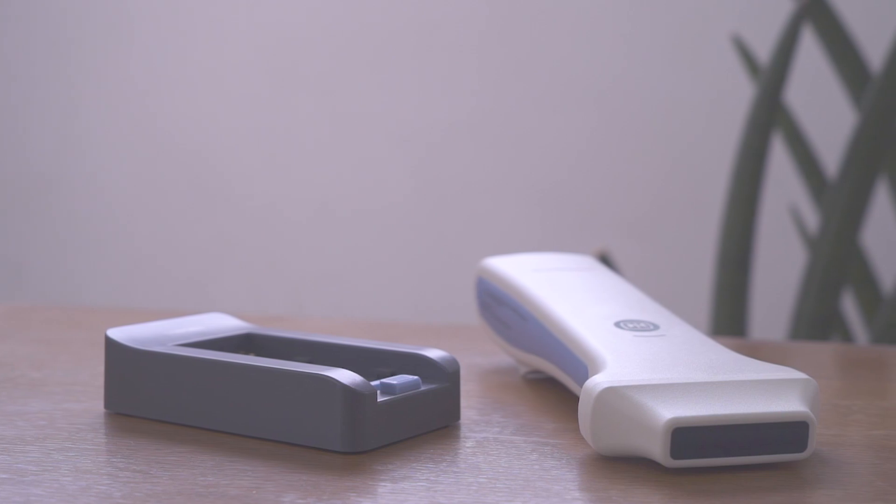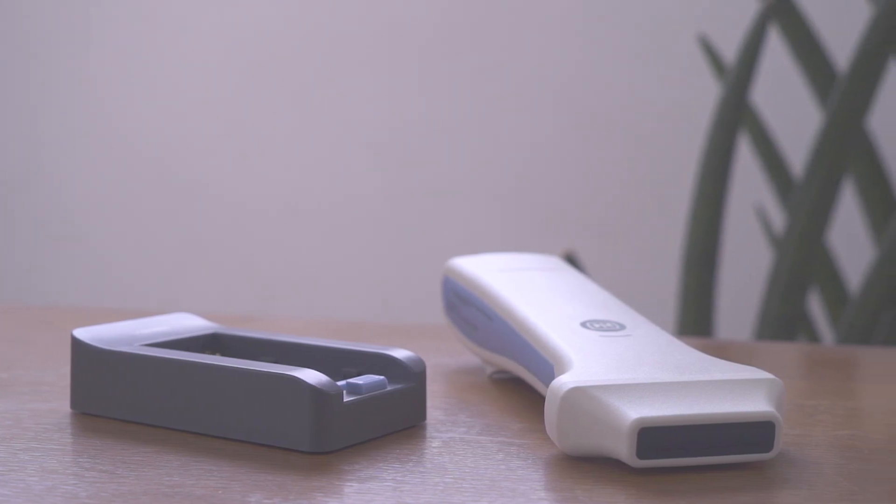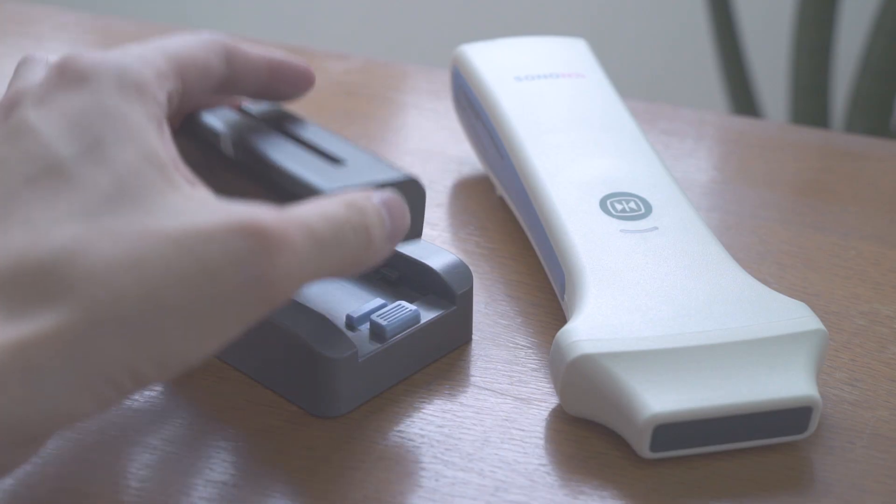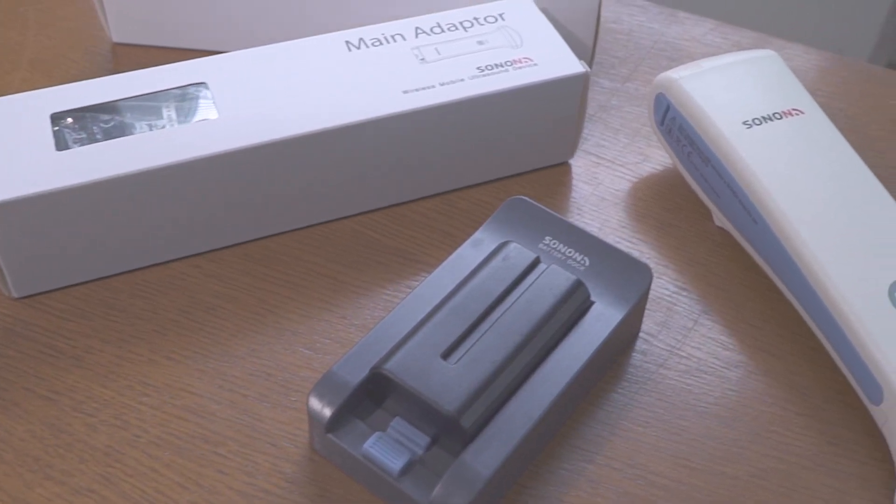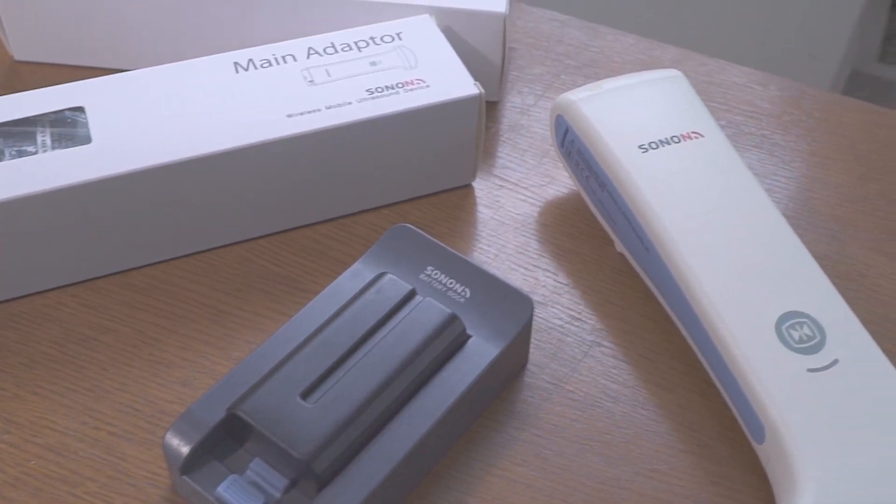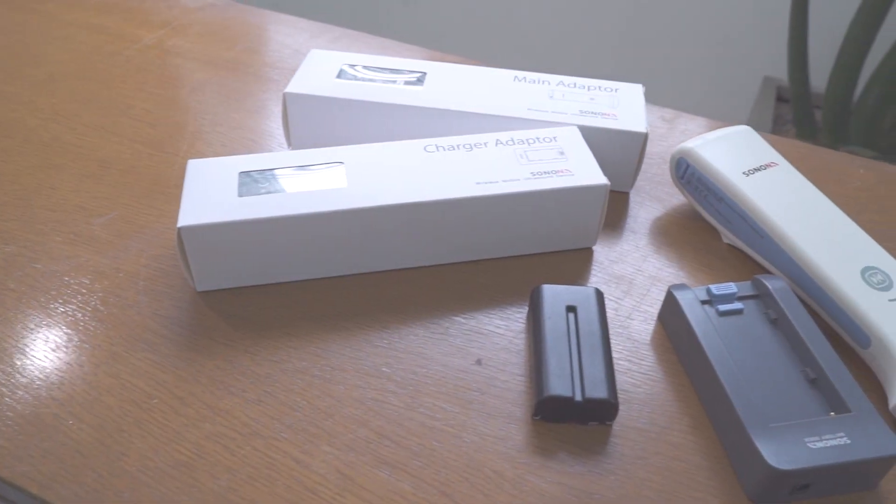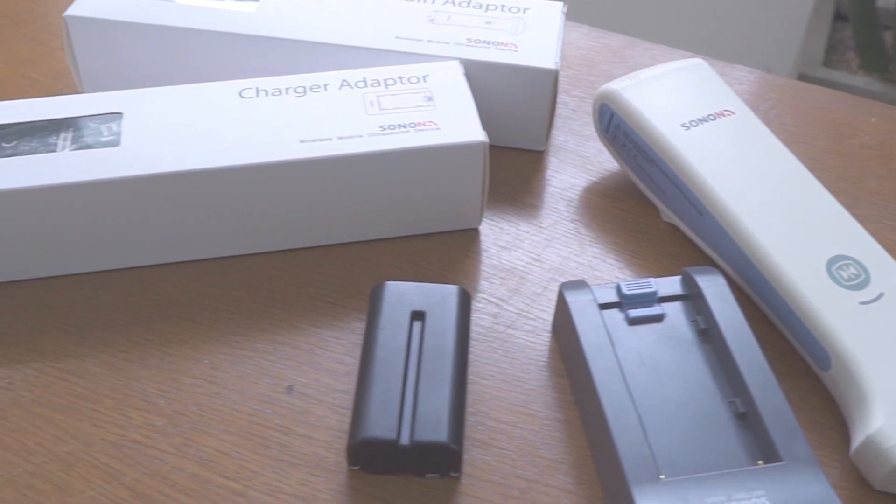Each package contains two replaceable batteries, chargeable battery dock and an adapter, with a selected type of probe that can last up to 12 hours of standby and 3 hours of continuous scanning.